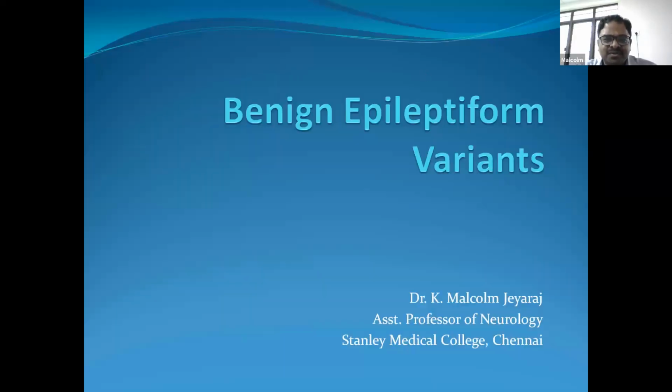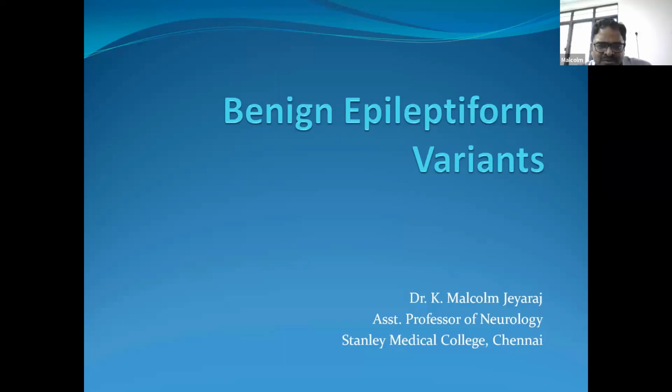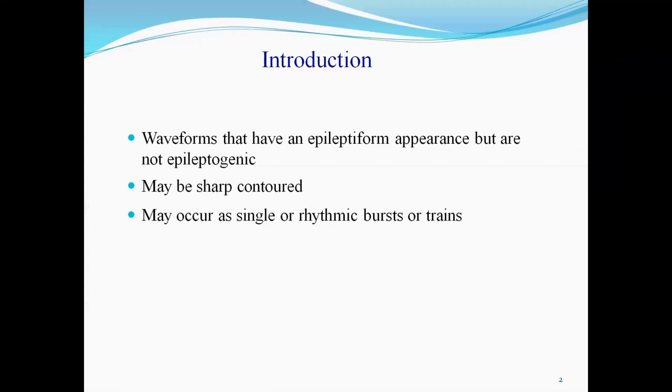At the outset, a very good afternoon to all. I thank Professor Arvind, sir, for giving me this opportunity to be with you through Zoom to share on benign epileptiform variants. Waveforms that have an epileptiform appearance but are not epileptogenic are considered as benign epileptiform variants.